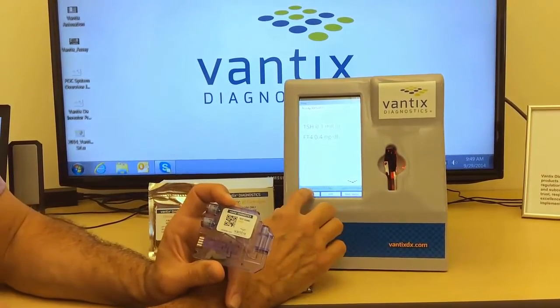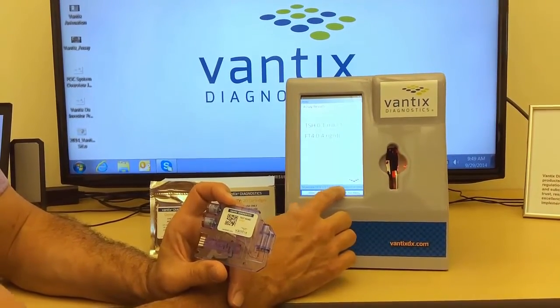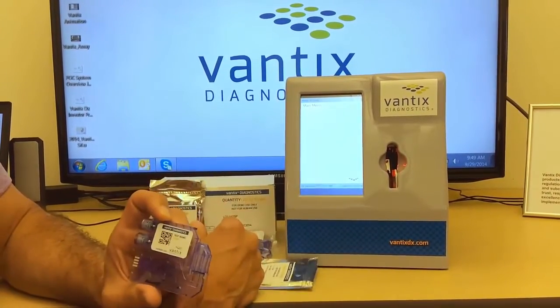You can export the results to a printer or back to the medical records. And then when completed, you go back to the main menu.